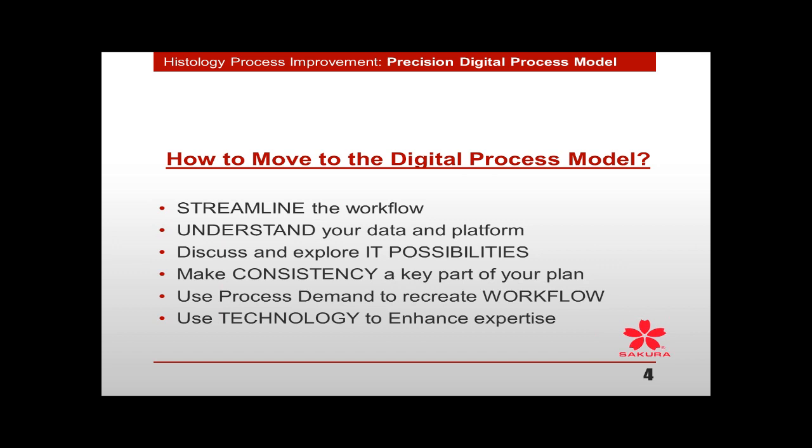You're trying to make sure that you move your tissue sample through the tissue processing, through the cutting, through staining, as efficiently and as small batch as possible, so that you can quickly move it into the digital portion of your process. Because your pathologist, who's our customer, is sitting out there waiting for slides the same time as normal, and in today's atmosphere, they are probably going to get a combination of glass and digital.